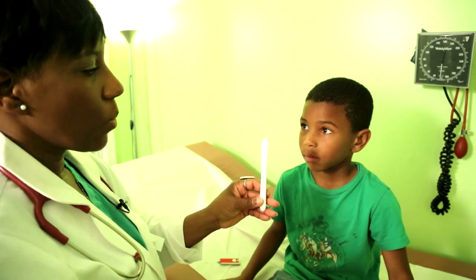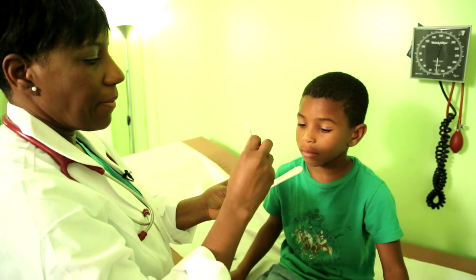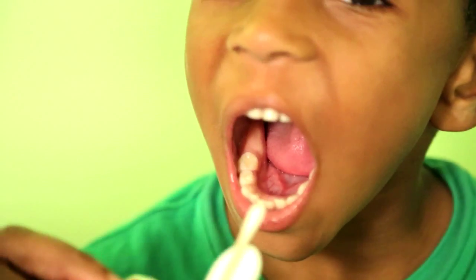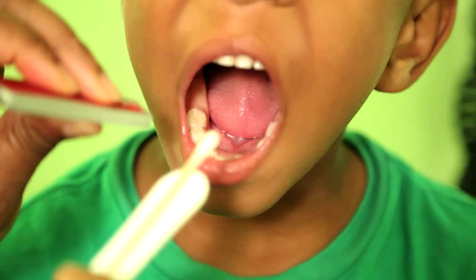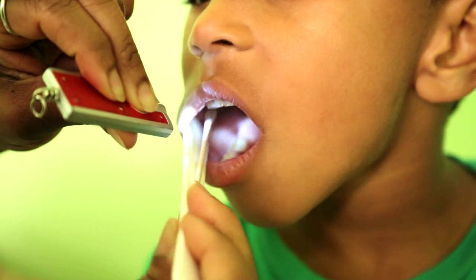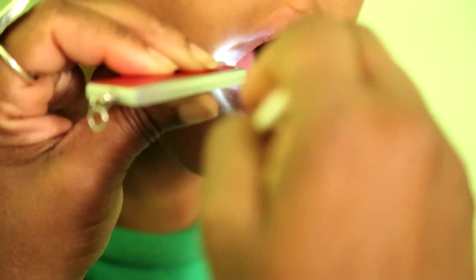So I'm using the SwabStix. I'm going to put the Q-tip inside of the SwabStix, which allows me better visualization, better stabilization of the child, and it allows me to have a free hand to use for light. On the side, it can depress the inside of the cheek, and I can swab at the same time, anywhere in the mouth.